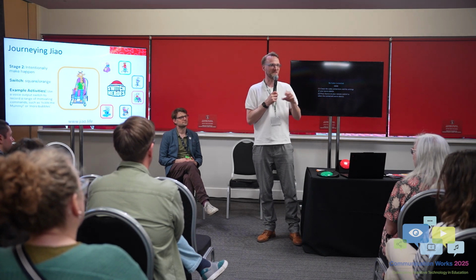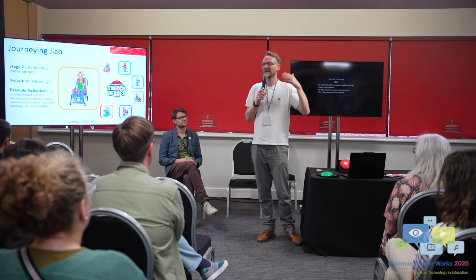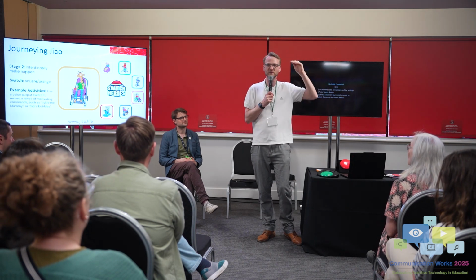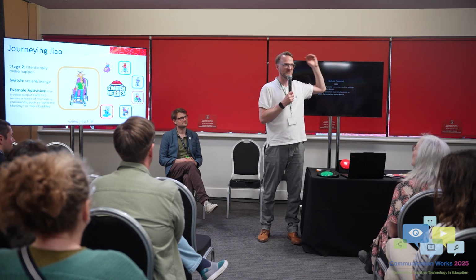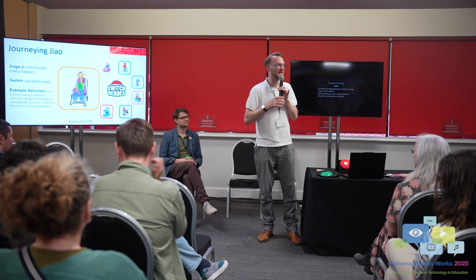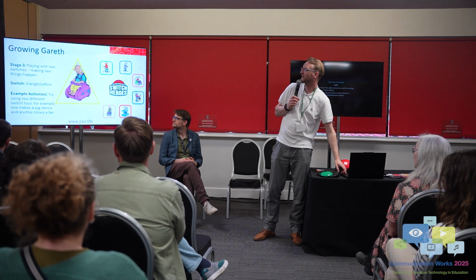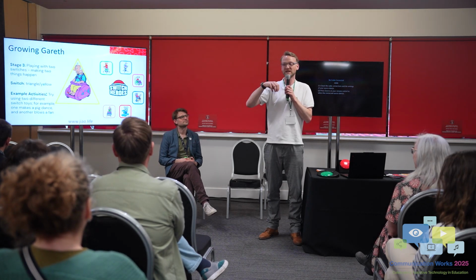And then you move on, once they've started to establish and they've shown some understanding that they can move their body and do it, then you want to start that motor pathway and get, I'd say, primary, secondary and dynamic switch sites. You get that primary one because every teacher and every TA and family member wants to know, where should I put the switch? But also say there's a secondary one, use their head, but their hand, and then maybe dynamic and be a little bit crazy. Explore. And then once we've done that, we start to grow. So we stop journeying and we start to grow.